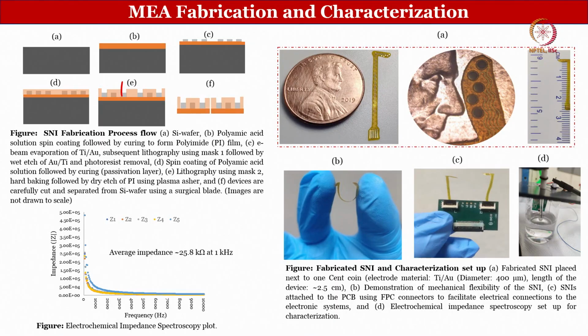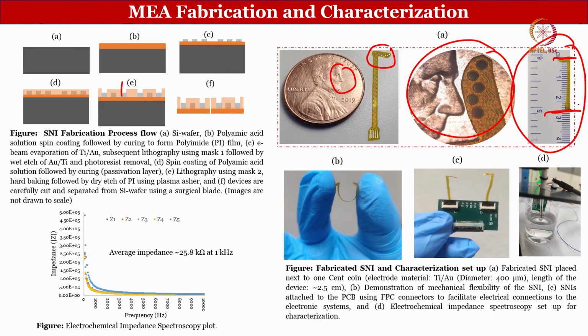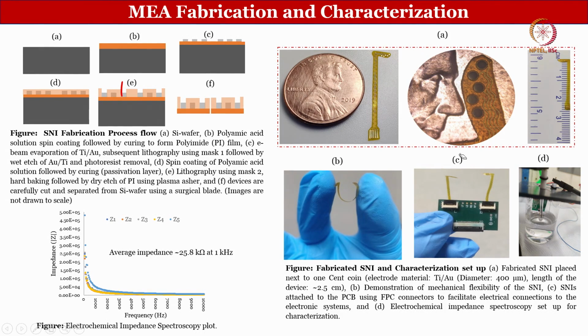But sometimes a lot of us may not have seen a cent actually. So, we will not know, and that is why I also have a scale bar here. So, when you zoom into this much area and you put this device, as you can see here, what is the size? The size is close to this, with a scale bar. So, the point that I am making is that sometimes we need to make sure what we are representing and how well we are representing our device. For people who understand the diameter of 1 cent, it is easier to look at the cent and see, oh, this device is really tiny. For people who may not understand, we can always show with a scale bar or a ruler. So, whatever is easier.